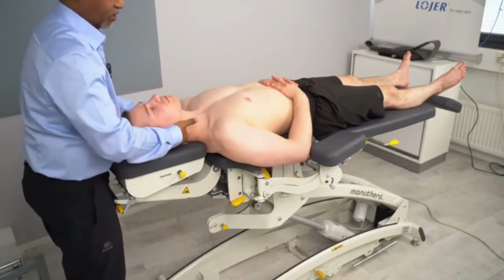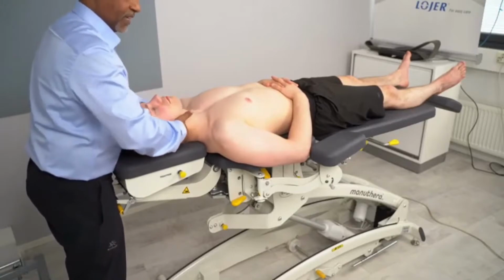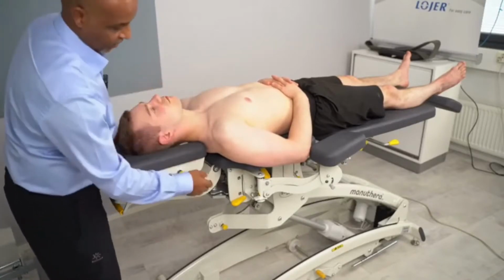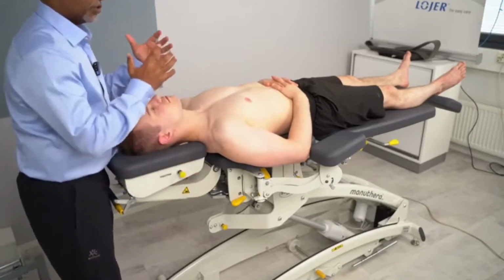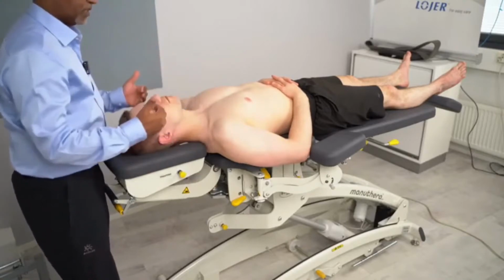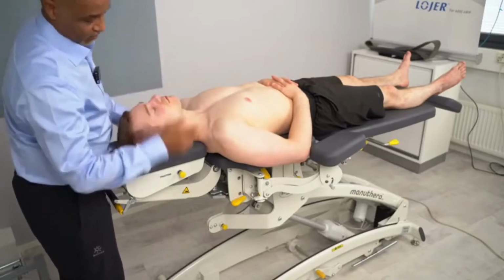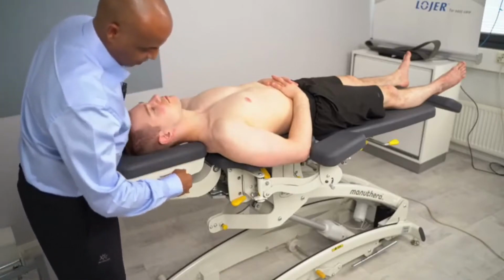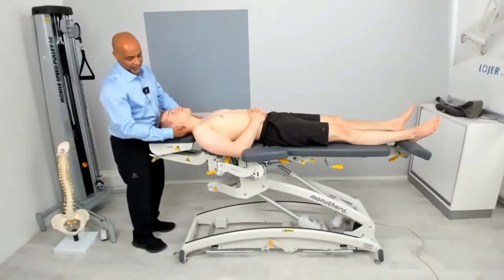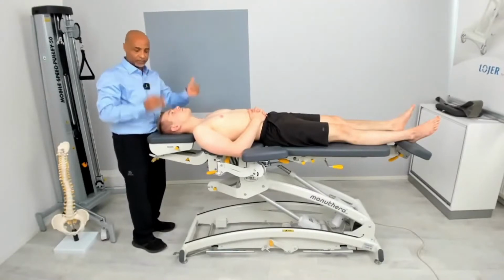Once you're done, you can give it a nice massage to release the tension. And then I need to think about the traction. That traction is going to be used to release that pressure. Now the facet joint is open and the muscles have been worked on. The next phase is the traction to release more tension in the deep muscles. So I'm going to activate this particular knob, which gives me the traction of the neck. But again, we must remember that when you do traction, the neck has to be in a straight line all the time.